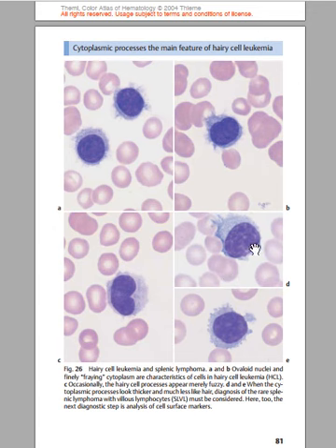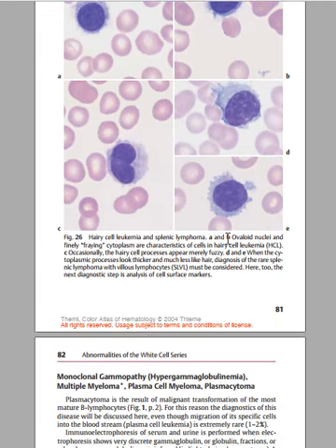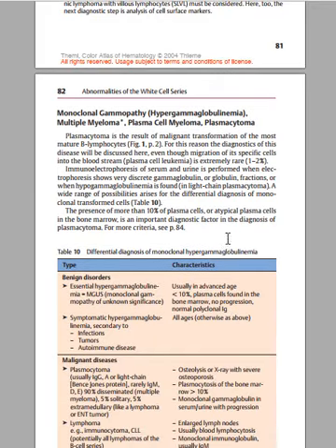The diagnosis of the rare splenic lymphoma with villous lymphocytes must be considered when you have this. So when you have a lymphocyte which has a very large cytoplasm, is it clear? And you still have hairs, but the hairs are decreased. You have to think of the rare splenic lymphoma with villous lymphocytes.